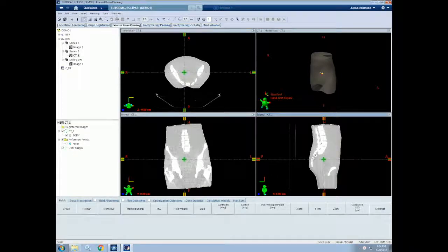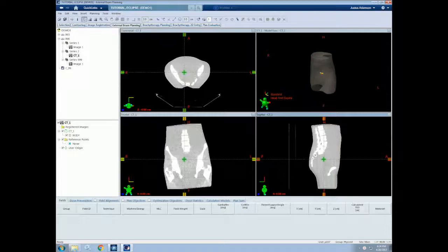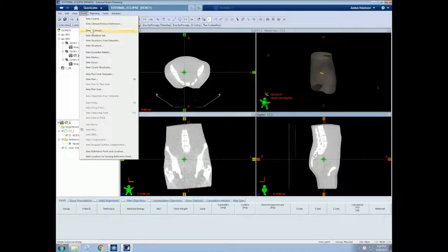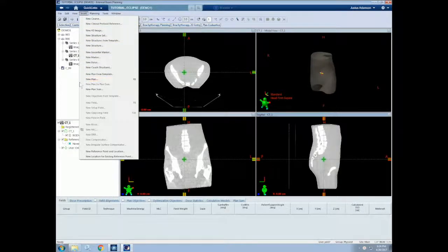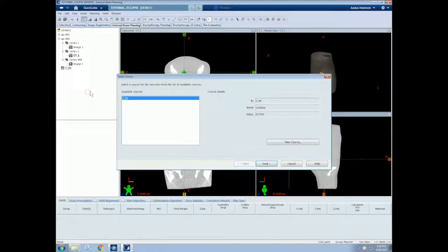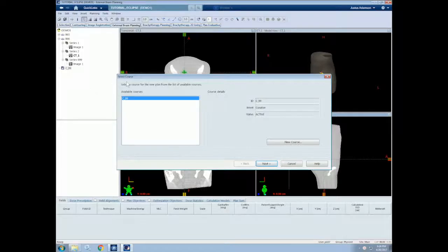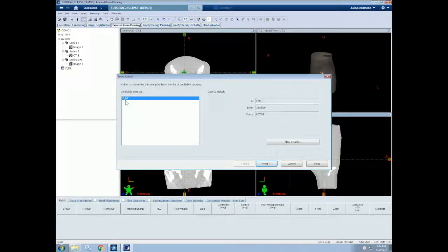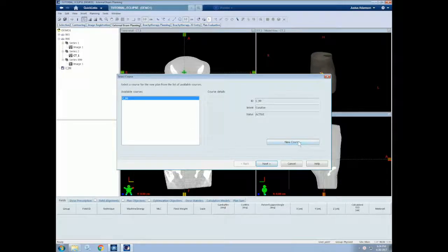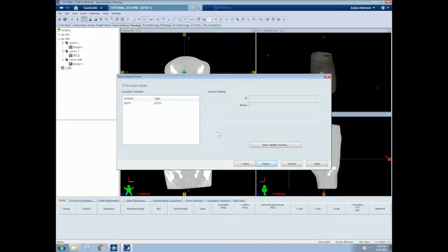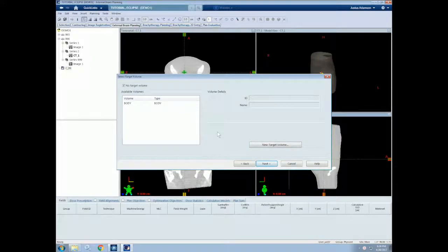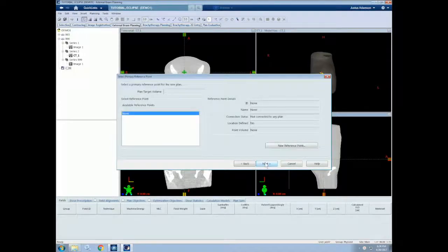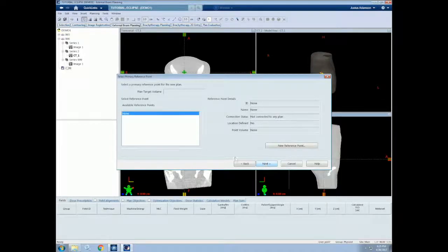Now that we have our course, we can create a plan. Similarly to creating a course, we can create a plan by either going to the Insert menu and clicking New Plan, or we can right-click on our course and select New Plan. We'll be given a series of prompts when creating a new plan. First, we can select what course we want to put this plan into. So the only course we have now is our C99 course. We can also select a new course if we'd like. Next, we must use a target volume. We'll typically have a PTV structure from contouring to use as our target volume. So for now, we'll leave no target volume.